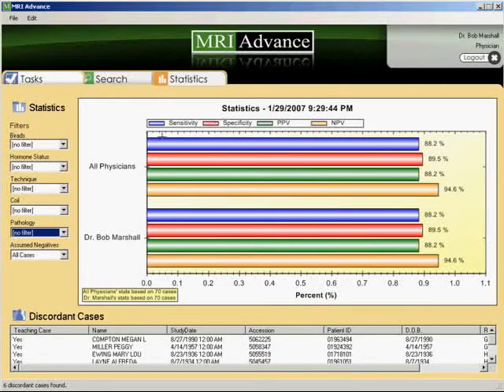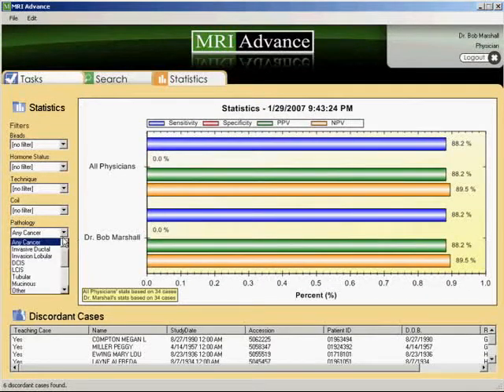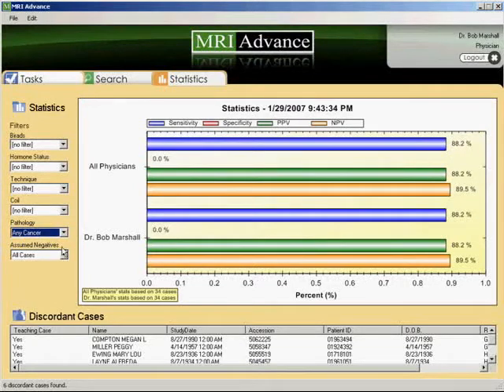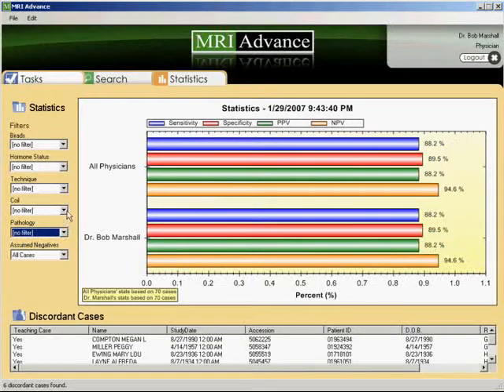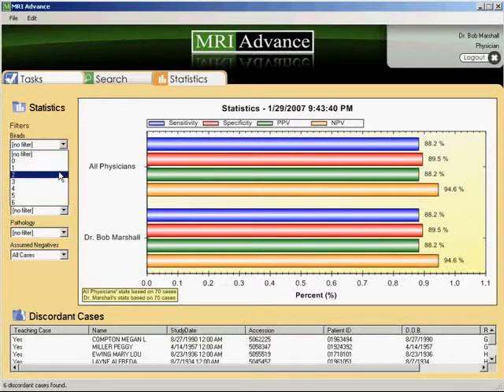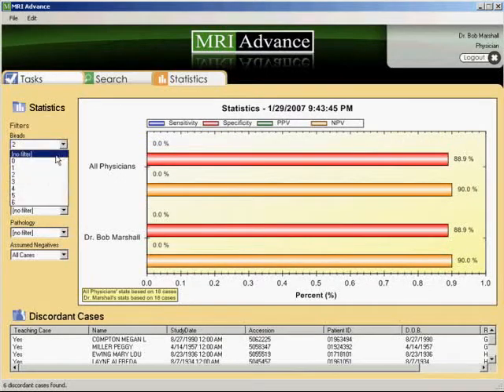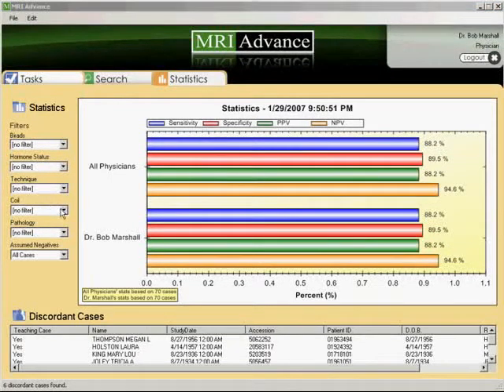The next component of the software is the statistical analysis component. Opening the statistics section will yield the total number of cases currently entered in your program, as well as the sensitivity, specificity, positive, and negative predictive values for your program as a whole. Statistics can, however, be further evaluated by individual parameters. For example, besides knowing the overall sensitivity and specificity of your program, you could assess what your statistics are for invasive ductal cancer versus ductal carcinoma in situ.